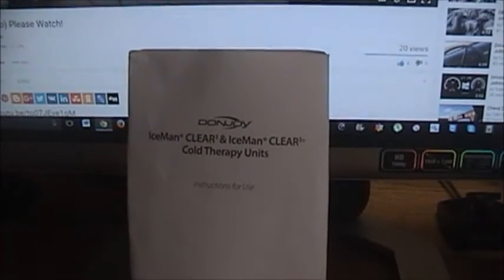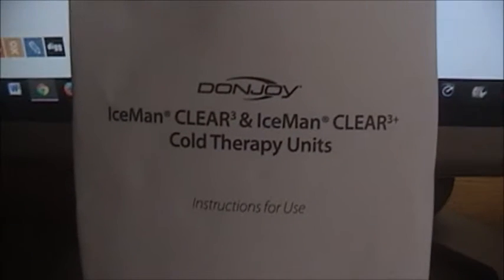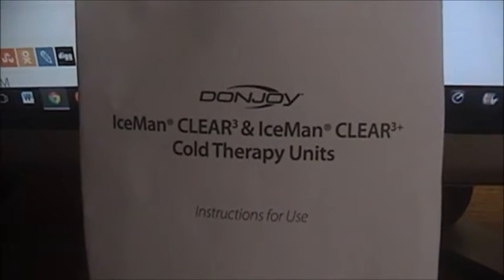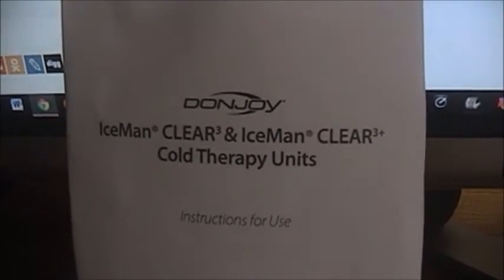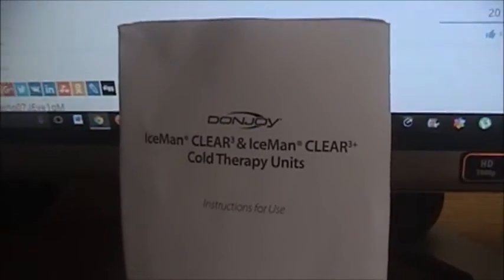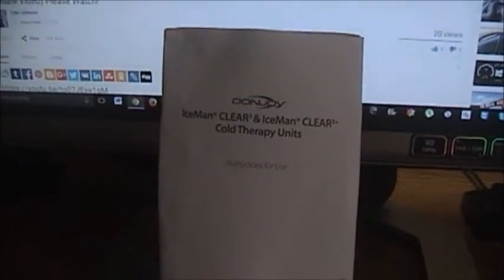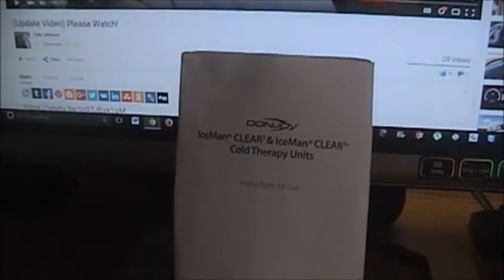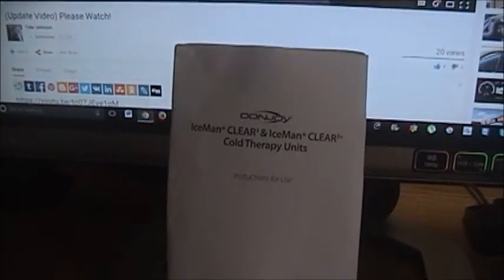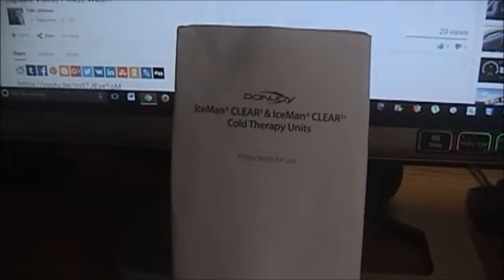So what they gave her at the hospital to use, and luckily she got to take it home, is this thing right here. This is the DonJoy, I hope I'm pronouncing that right, IceMan Clear 3 and IceMan Clear 3 Plus cold therapy units. Now basically what this is, it's a cooler. You put either ice in it, or as I'll show you later, we actually use frozen water bottles. And it has a hose that comes up to a little pad that wraps around the area where you're having the swelling or the inflammation, and it actually ices it so the swelling goes down.